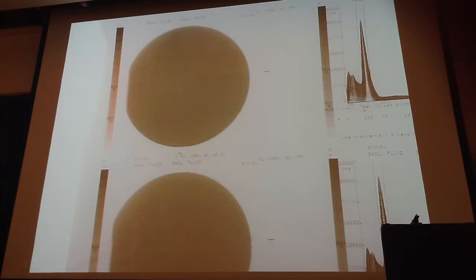The flood phantom is that hard shell that you inject the tech in there, it's filled with liquid. Yes, okay. The flood phantom is like a giant aquarium. You inject an amount of technetium in there, you shake it up, make sure it's well mixed, and then you put it on top of your collimator. The problem with that is that it's messy.